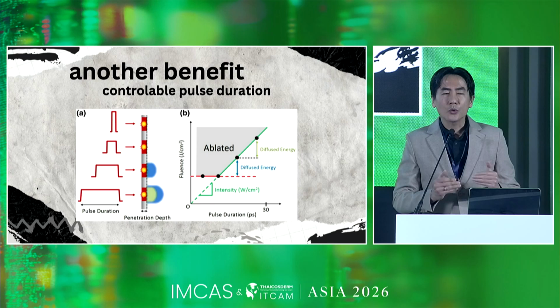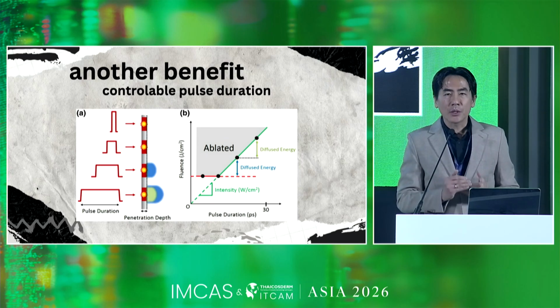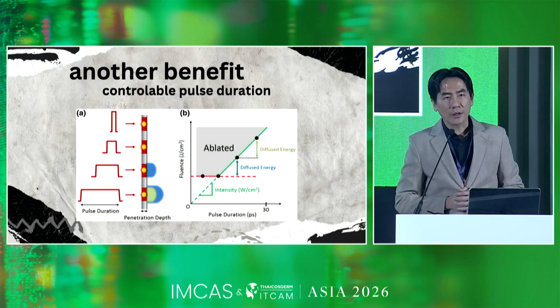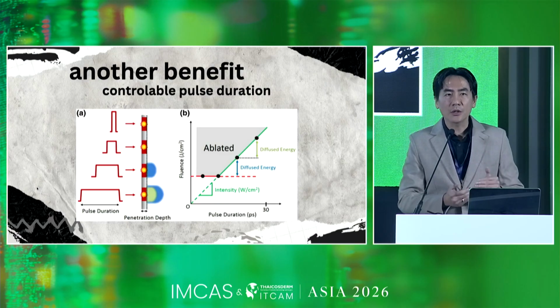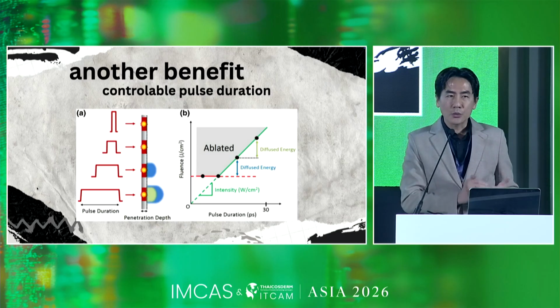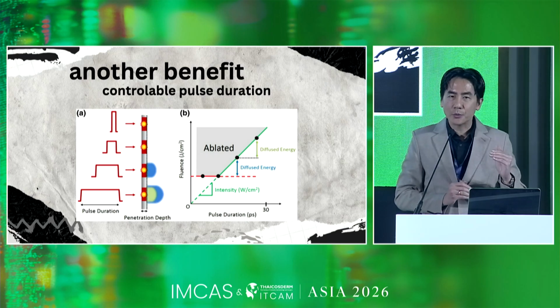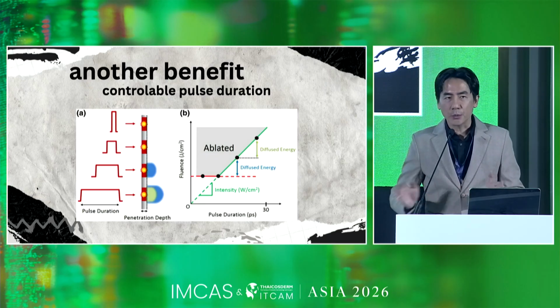Basically, we try to create less ablation and less damage to our cells, but we try to create bulk heating, bulk stimulation. It's slightly different from the Oligeo using monopolar RF. The Oligeo tries to create bulk heating in the deeper layers, most likely the deep dermis. But using the thulium laser, I can stimulate the thermal effect from the superficial, from the epidermis to the basal membrane and slightly the papillary dermis. So it complements the Oligeo.